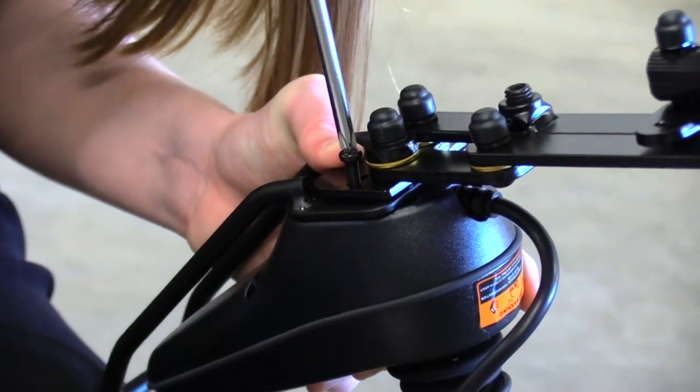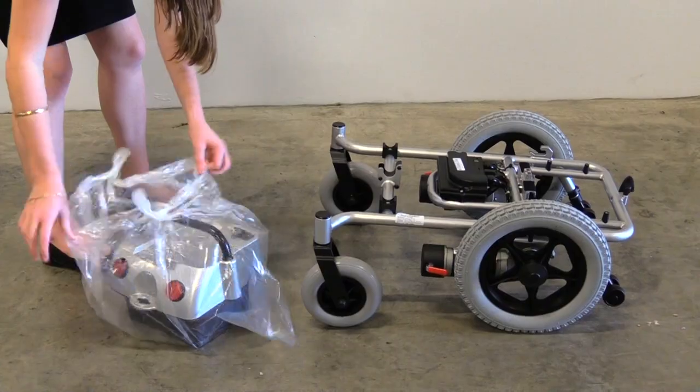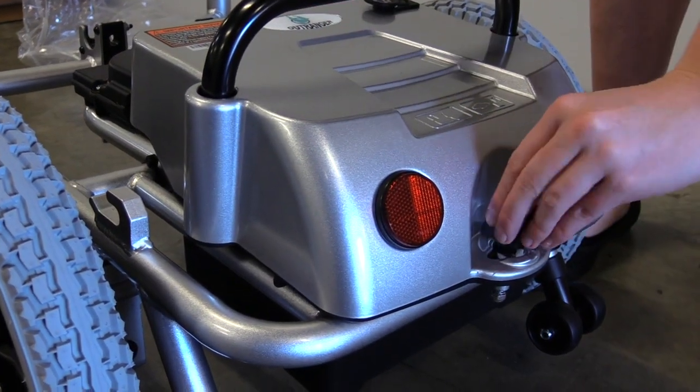Your control panel will have already been put together by our warehouse professionals. Unpack the battery and mount it to the mainframe. Once the battery is correctly aligned, turn the tension knob to secure it in place.